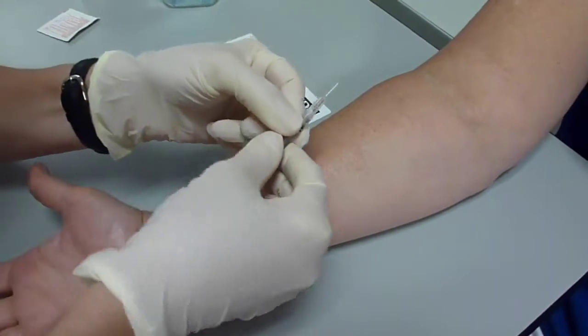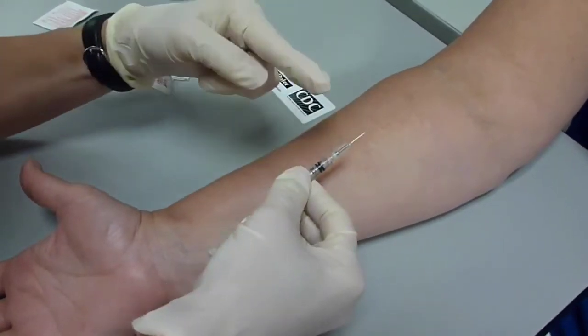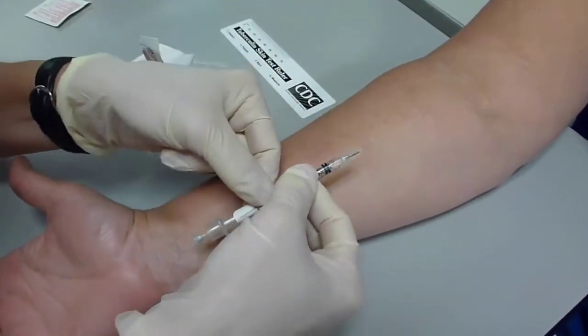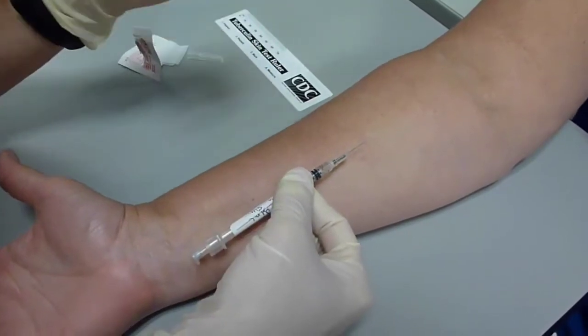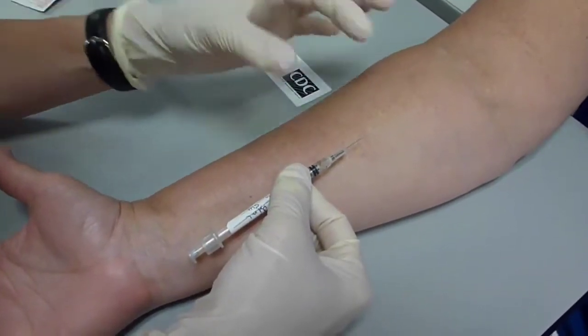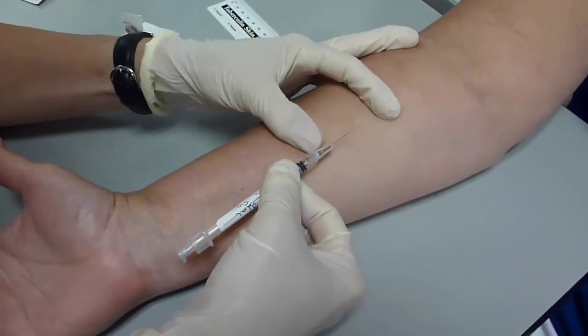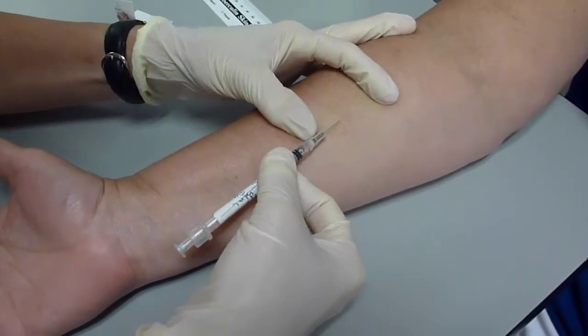you're going to uncap your needle. Be sure that your bevel is up and that you're using a TB syringe with a short bevel. The syringe is at a 5 to 15 degree angle and pull the skin taut. This allows you to get between the skin layers.